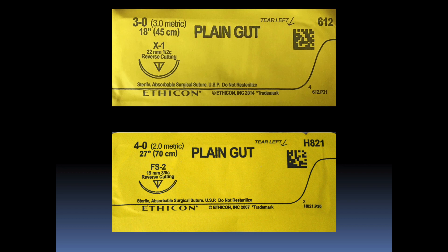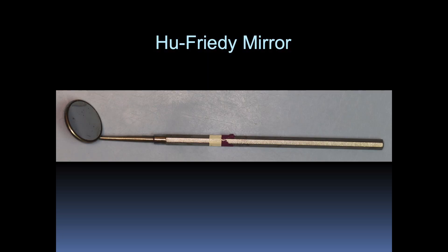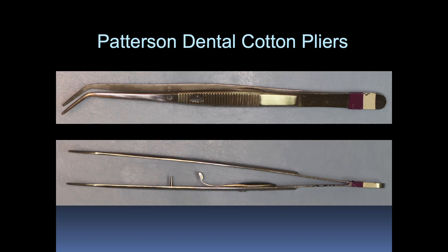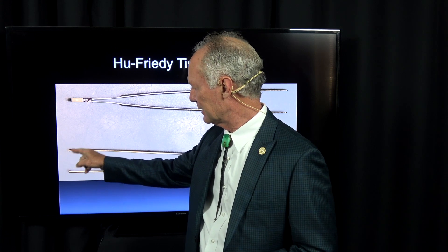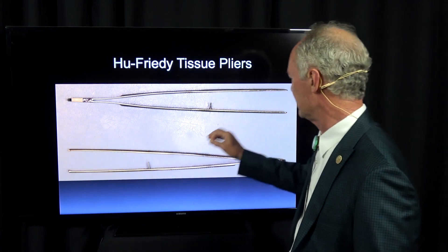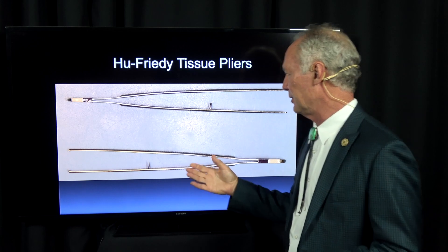I normally use 3-0 or 4-0 gut suture in oral surgery if I'm extracting teeth or grafting. Just a mirror, cheek retractor, cotton pliers. Now these are tissue pliers or tissue forceps — this one has got little teeth on the tip for grasping tissue. This one doesn't have any teeth and is good for grasping suture or different things.